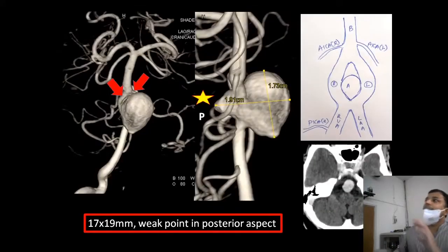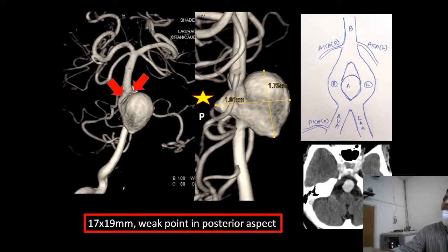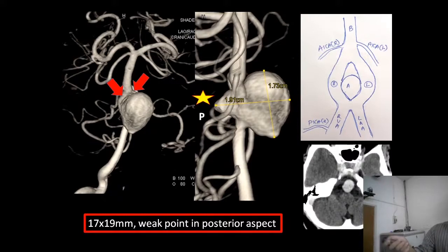On the 3D reconstructed images, we can clearly see two limbs associated with this aneurysm. Normally the basilar artery is a single channel, but here we see two limbs — this is called fenestration, a well-known term in the literature. On the lateral view, the aneurysm measures 17 by 19 mm. On the posterior aspect, there is a triangular outpouching which is more prone to rupture.